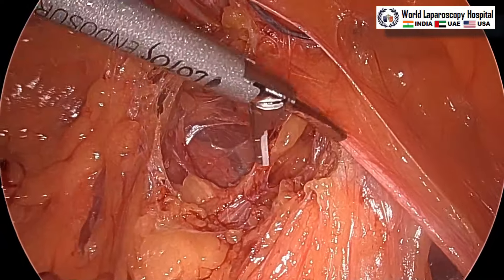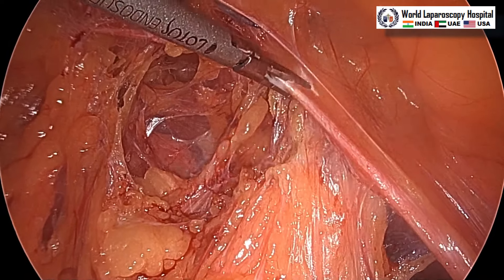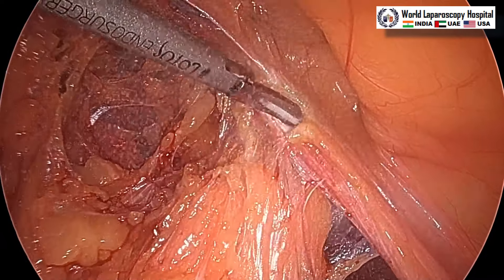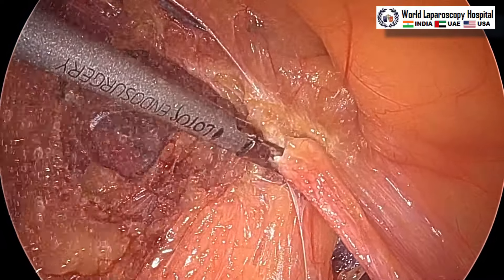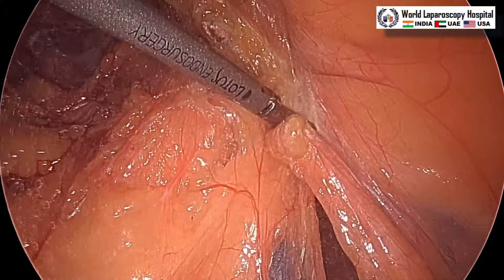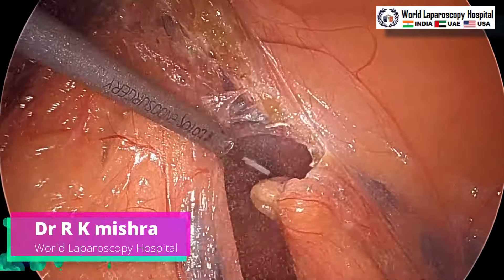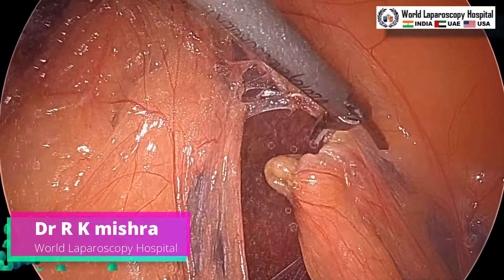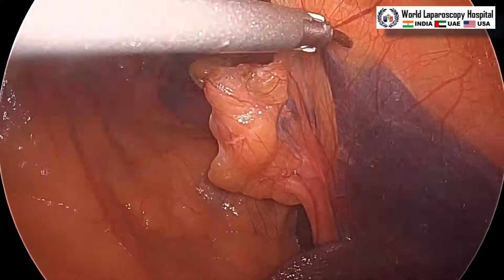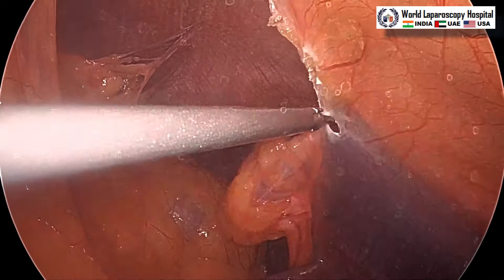We can see the falciform ligament and we have to cut the fatty part of the falciform ligament as well, so that at least 6 centimeters all around the defect we can have a domain to fix the mesh and to do the trans-fascial fixation. The harmonic has the advantage that it will coagulate as well as cut, so you do not need scissors. You may use LigaSure, but harmonic is a better scalpel and better dissector compared to LigaSure.